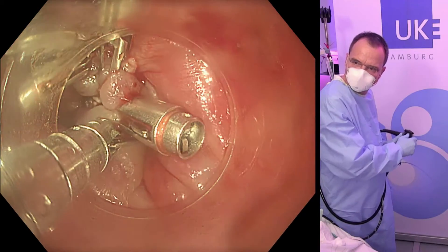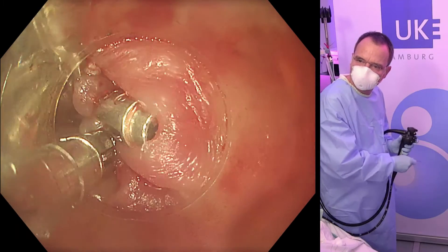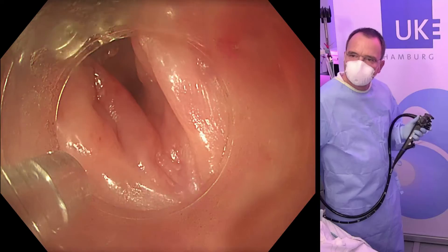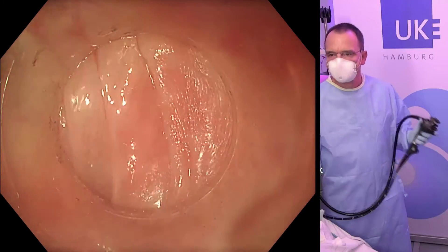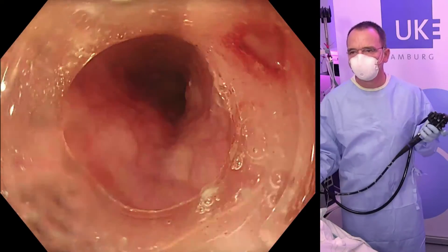Here we have the final clips to fully close the opening. The instrument has to be manipulated to see whether we can fire — yes we can. Finally, we do a check into the esophageal lumen, as you can see here, which ends the procedure.